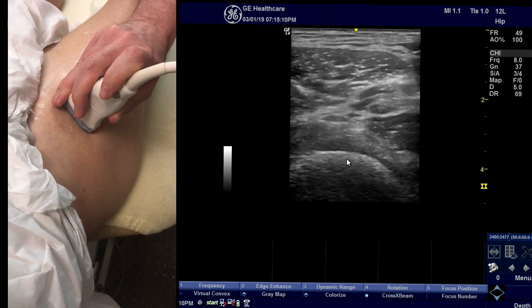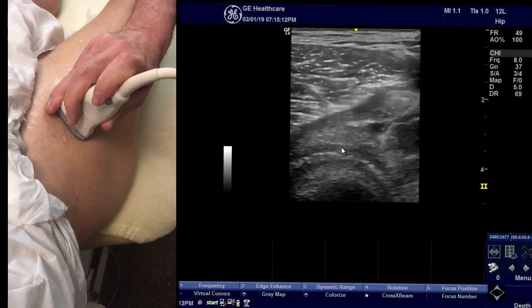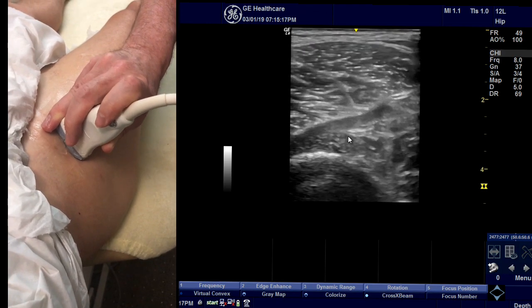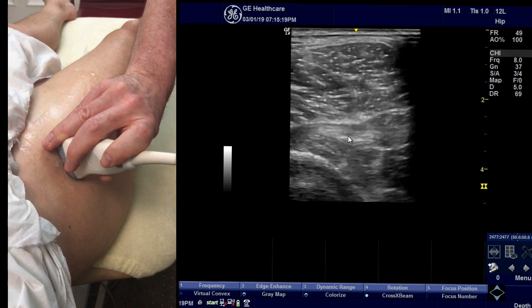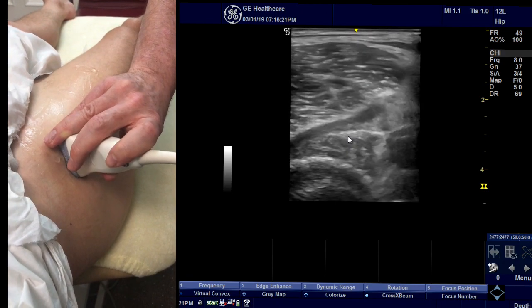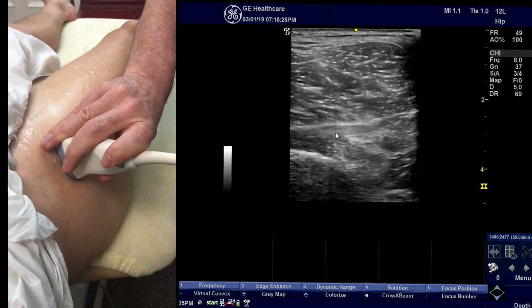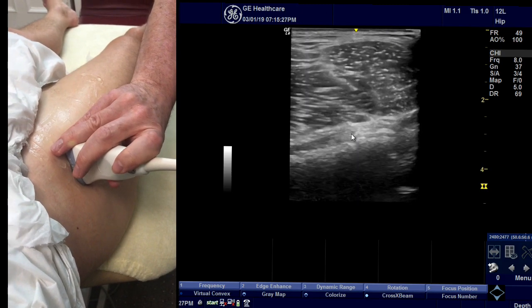If you come back a little bit you'll see the femoral head, and this then is the acetabulum. Once you've got your angle, you can come all the way around in that same plane, just as if you're slicing through an orange, and you can get the fibres nice and parallel for examination.